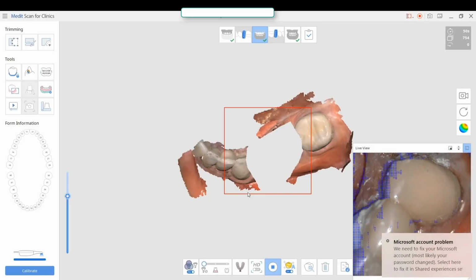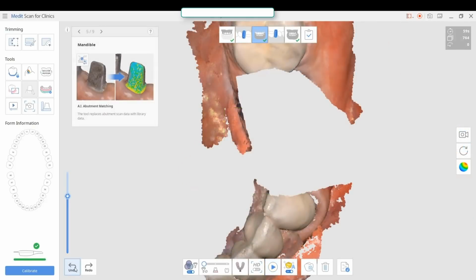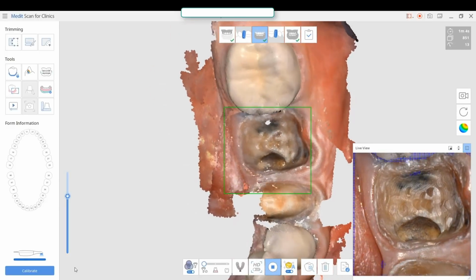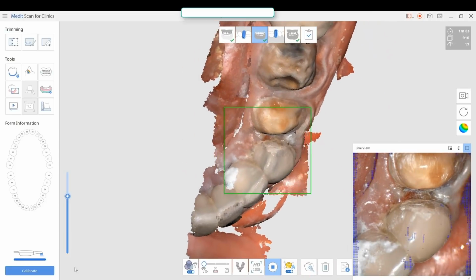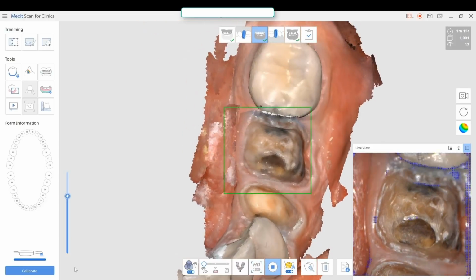So we'll turn the camera on and we'll engage the area mesial to the preparation, and of course getting good retraction and getting good hemostasis is really important. And now we start imaging the first premolar and the first molar. We've got hemostasis in most of the area. I just packed some cord on the mesial of the first premolar and the distal of that second molar.